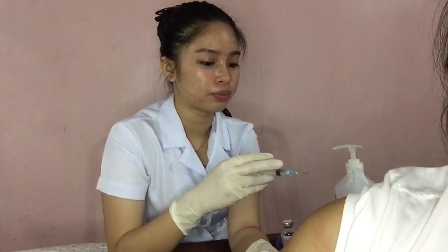Then help the patient to sit comfortably and expose only the area for the injection. Now disinfect the injection site in a circular pattern from inner to outer for about 2 inches. Now hold a cotton swab between the third and fourth fingers of your non-dominant hand. Then remove the needle cap by pulling it upward. Then hold the syringe with your thumb and forefinger like you are holding a dart. Place the ulnar side of your non-dominant hand just below the injection site. Hold this position until you pull out the needle.